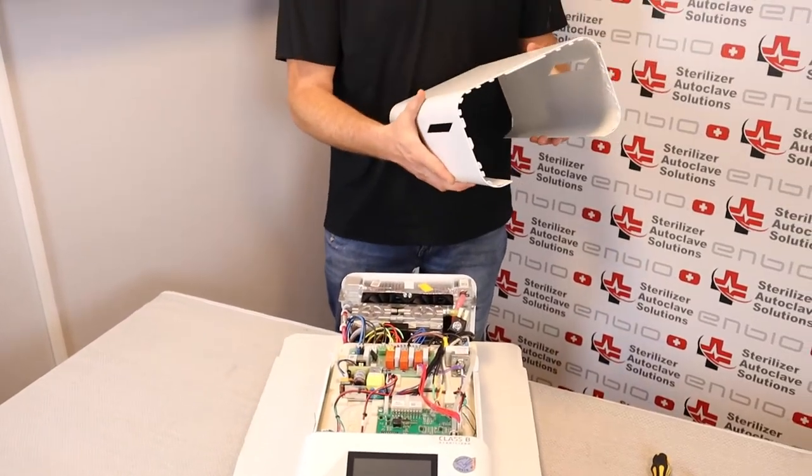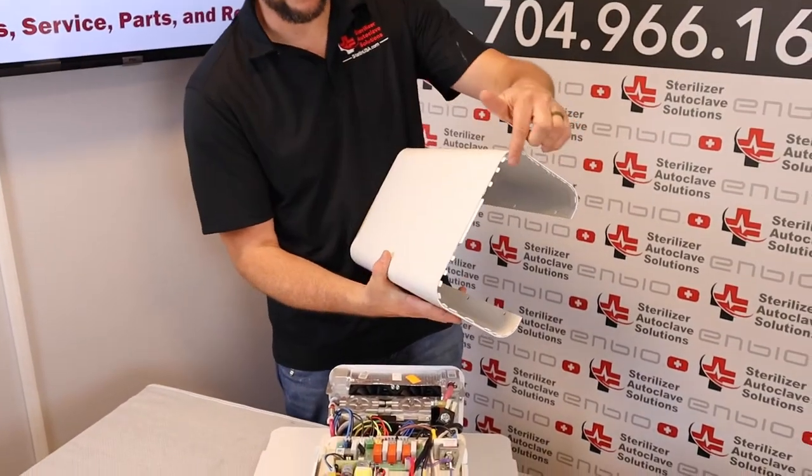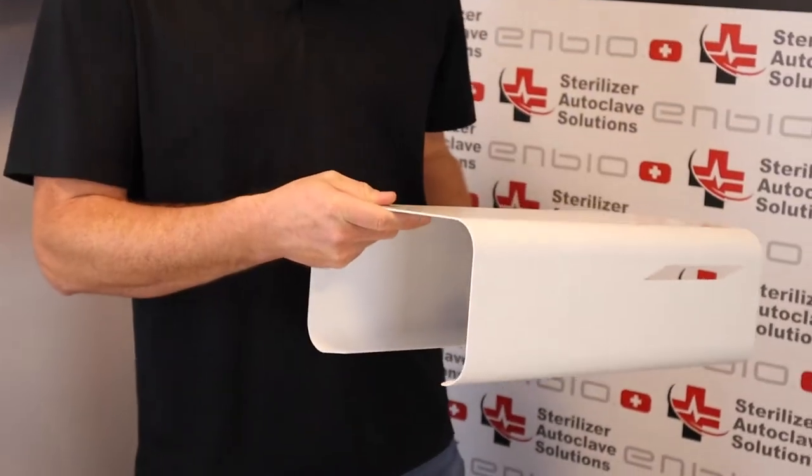First, what we're going to do is identify the front from the back. The front has the ribs. The back is just smooth.